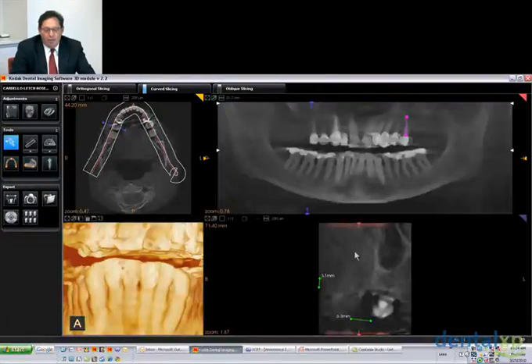And I show this to the patients, and I explain to them it's like a loaf of bread. Take a piece out, and this piece right here is that, and put it back in, or a book, and put it back into the bookshelf. But they do understand it, and they're riveted to it. And the reason I do that is to give them a clean bill of health.